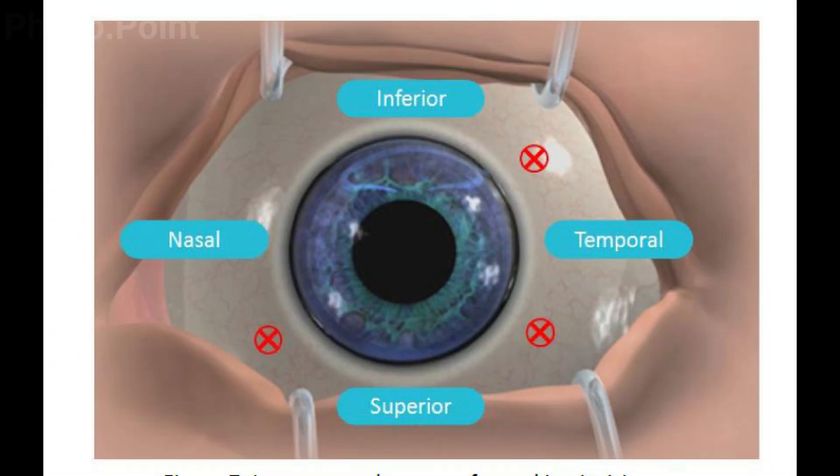The infusion is usually introduced through a port made in the inferior temporal plane. Inferior temporal is preferred because if it were placed inferior nasally, the nasal bridge would come in the way, making instrumentation awkward. The other two ports are created superior temporally and superior nasally, housing either the cutter or the light pipe, which are switched between nasal and temporal positions to access the target tissue.